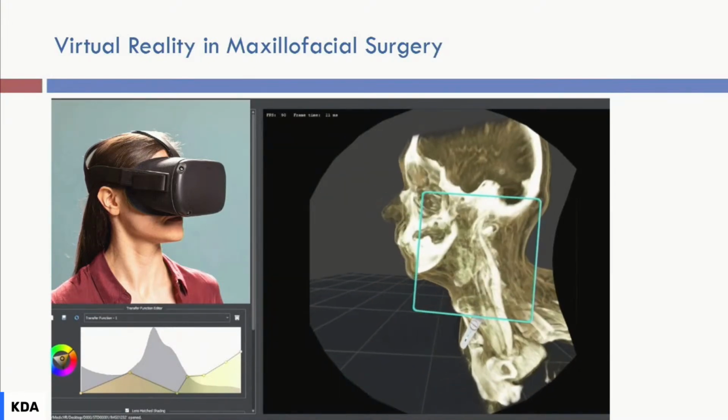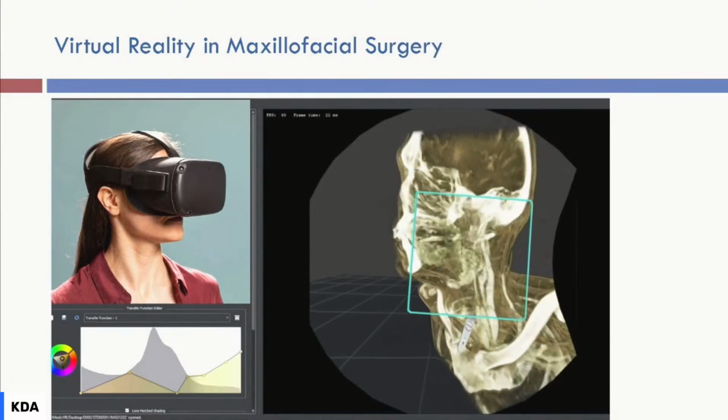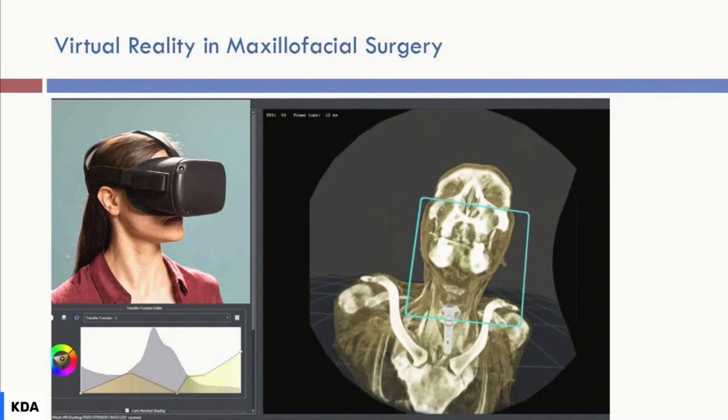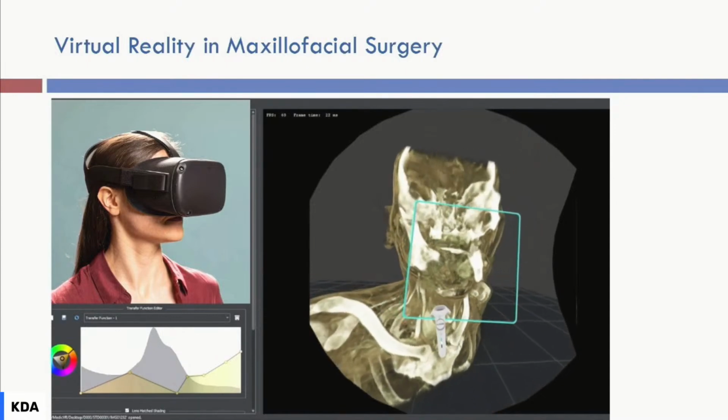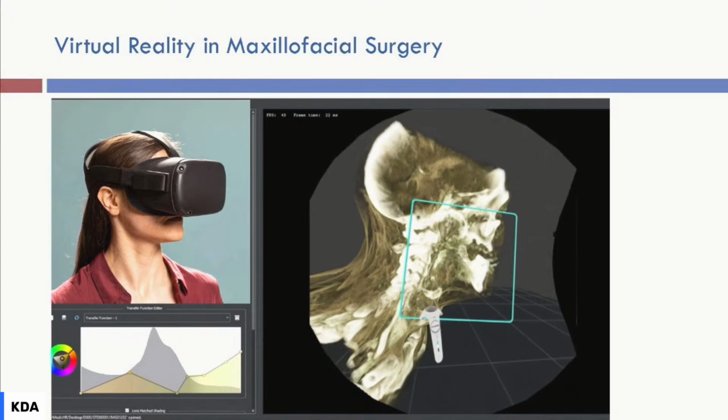So you can go all the way to the mental canal, mental nerve. You can enlarge, and you see yourself in front of the mental canal. Any structure. In this case, this patient has squamous cell carcinoma of the tongue. So you cannot see the colors now. We can color it. But the thing is, we enlarged, and we went through to the tumor. You sit in the middle of the tumor, and you move your head. You look at the tumor from a three-dimensional point of view.